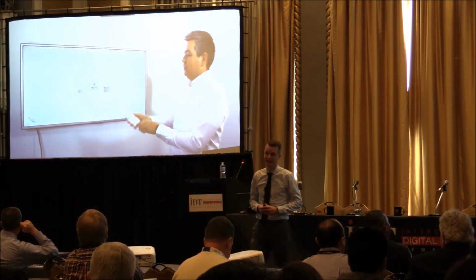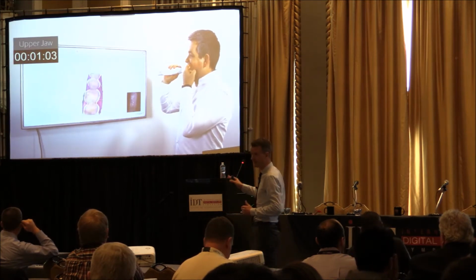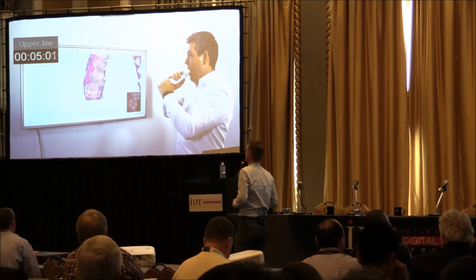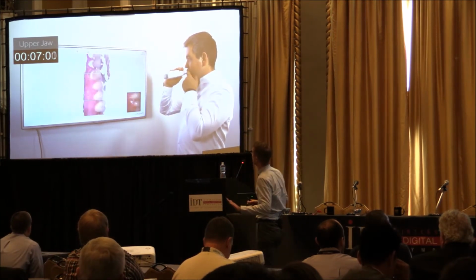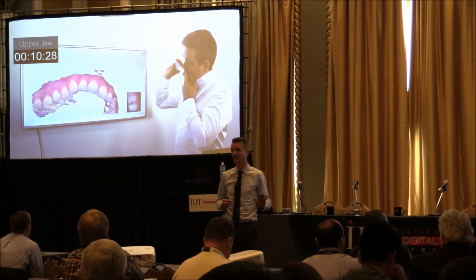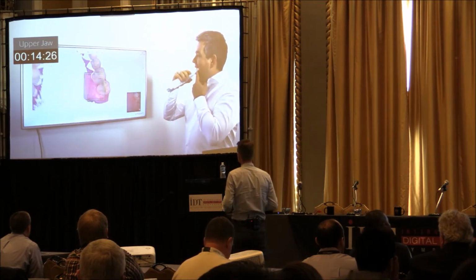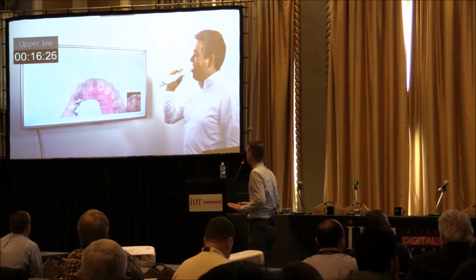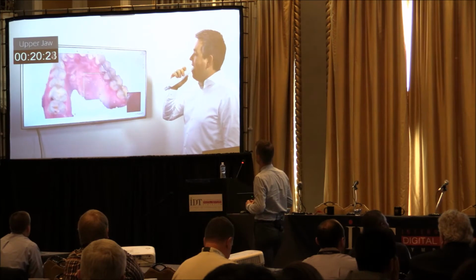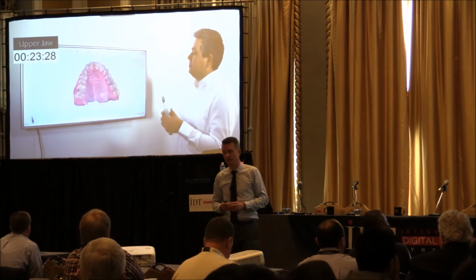So you will see scan times on edentulous which will come close to what you see here. One of the cool things about scanning the edentulous: the soft tissue is the problem, but when you come to the palate, it's super easy. It's actually easier to scan the palate area than it is to scan the teeth. You will see that in 2 seconds here. You can see it just moves around. He scans the teeth, and he scans the palate, and you can see how easy it is.